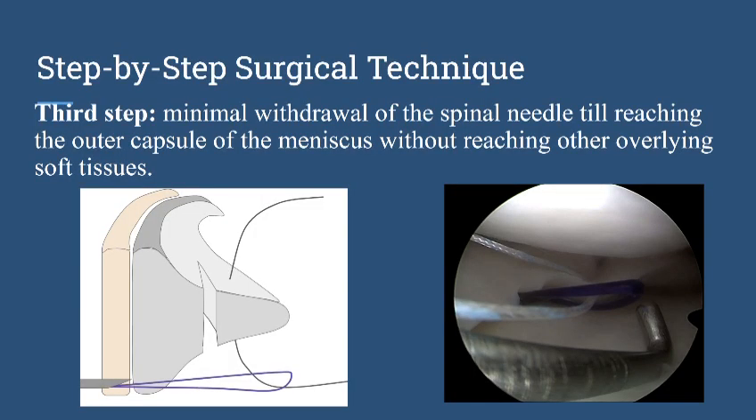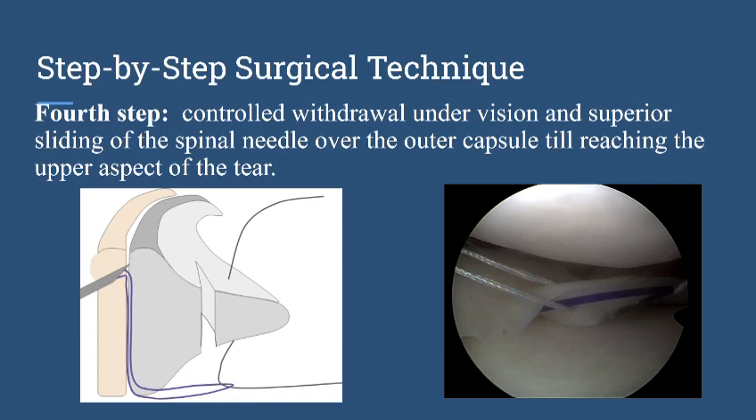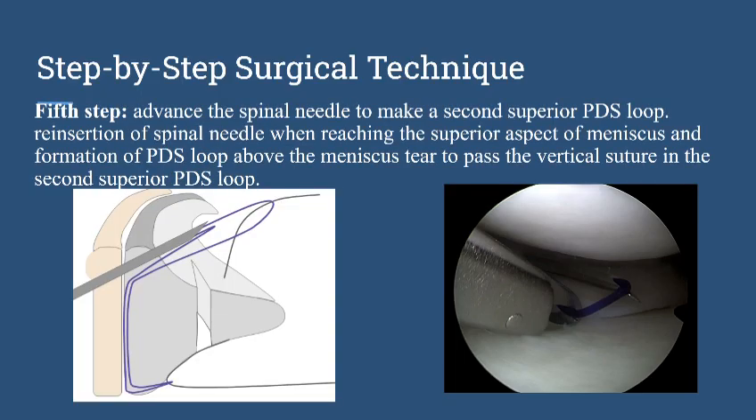After that we perform the third step, which is minimal withdrawal of the needle just to the outer limit of the capsule. After that we shift the needle up without going out of the skin through the same skin puncture, and then we advance the needle back inside the joint.